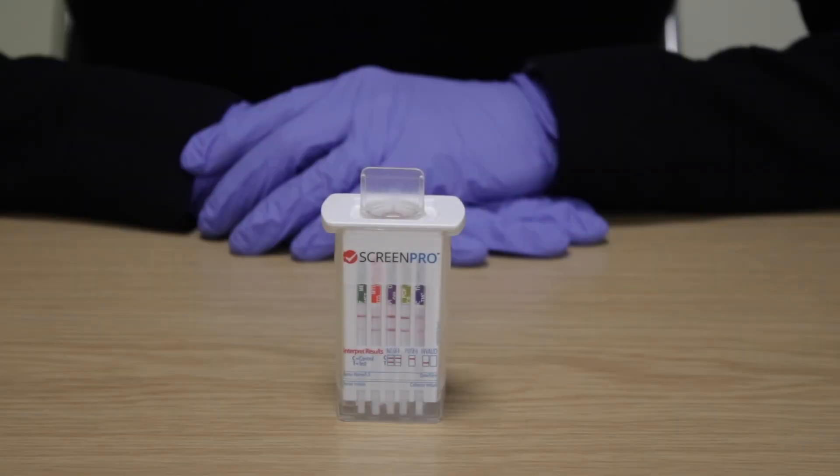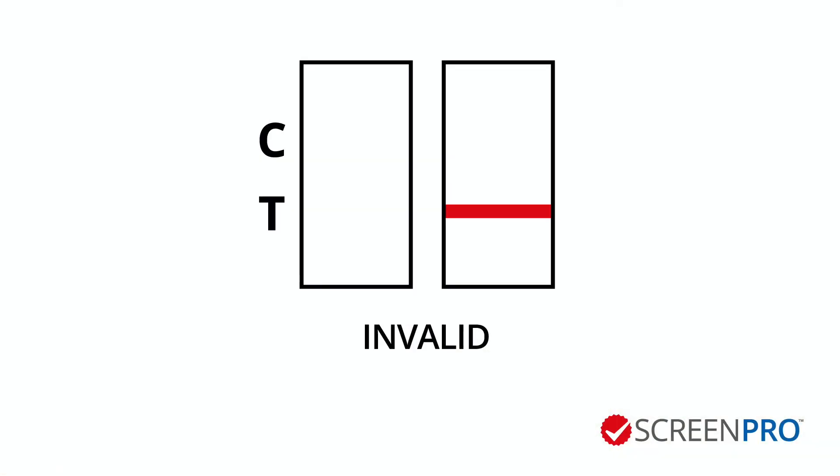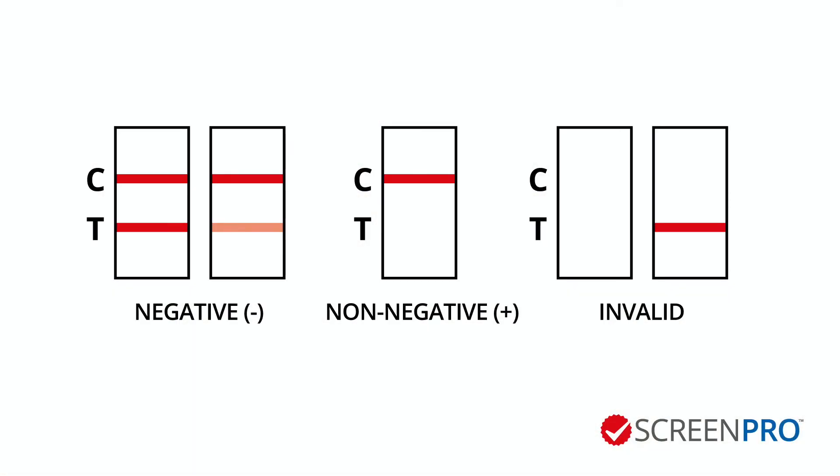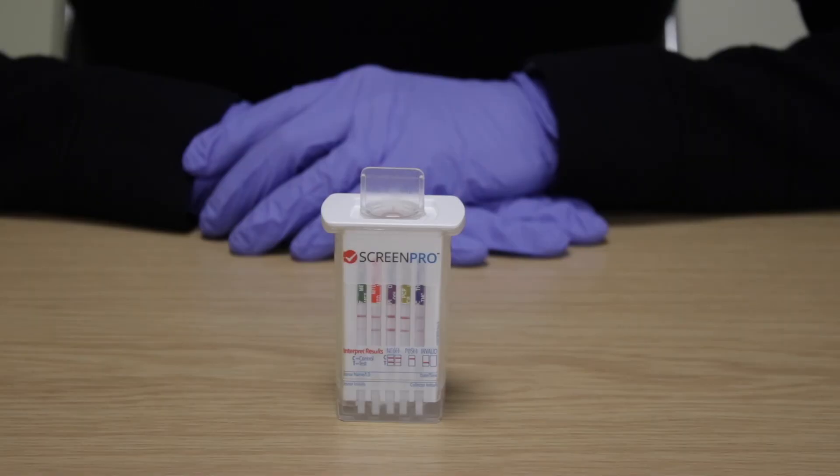Invalid. If a control line fails to appear on any individual test strip, the test result is invalid and should be repeated with a new cup. Please note, it is normal for the line intensity to vary. Any line, regardless of the intensity, colour or size, should be read as a line.